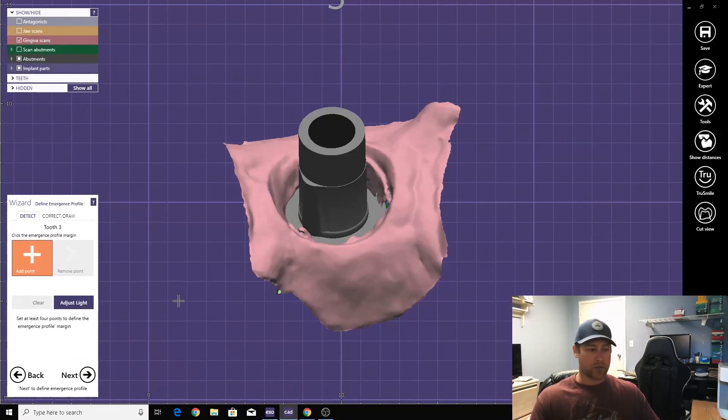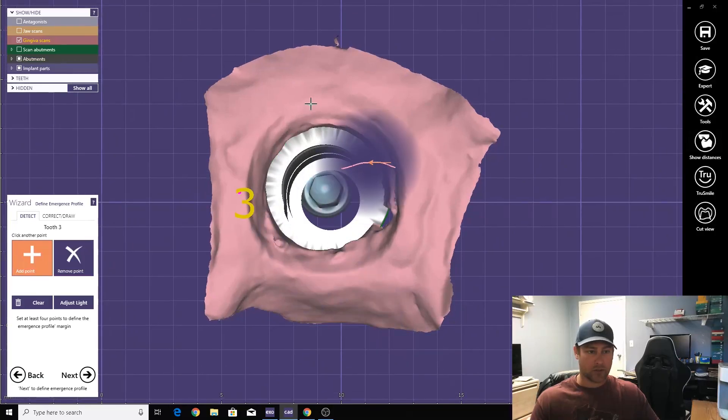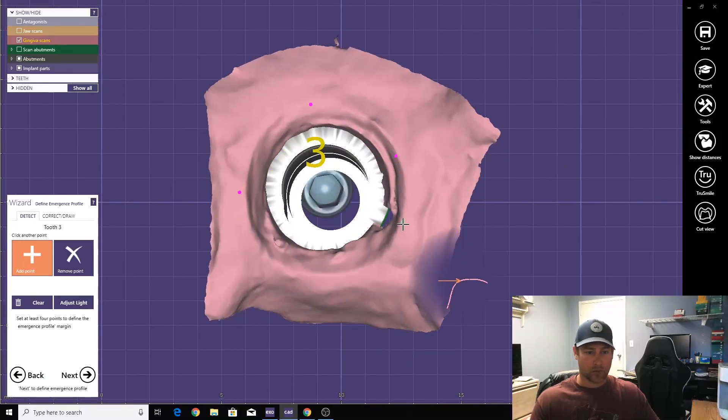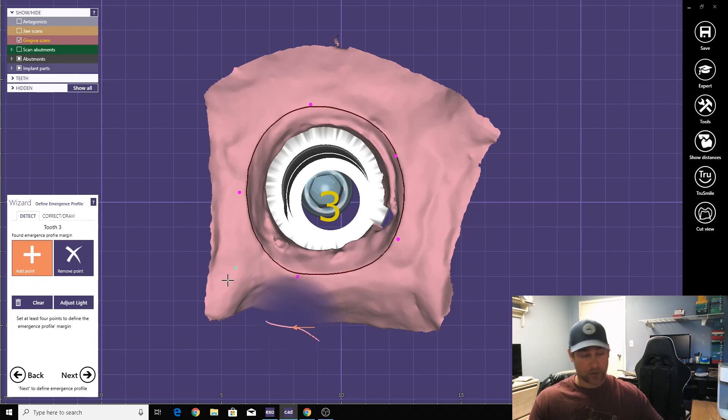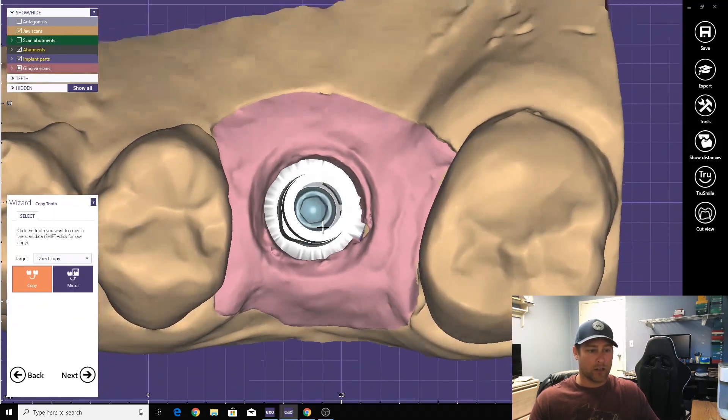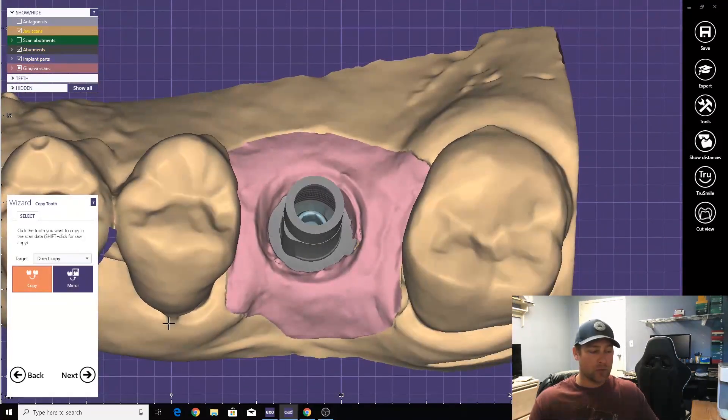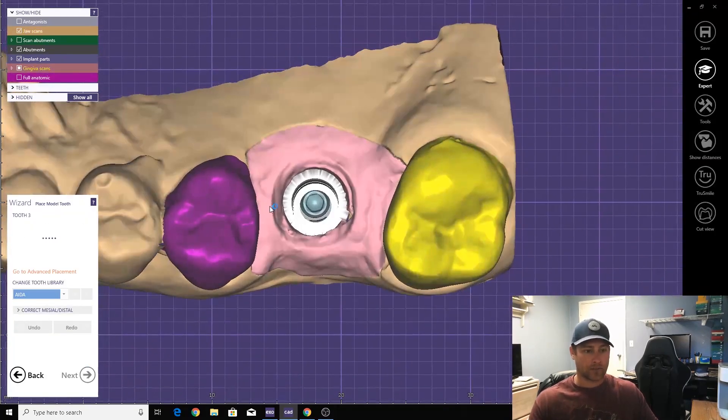Now we're going to define the emergence profile. Just four points, five points, whatever. Pretty simple. Now we're going to place a tooth here.